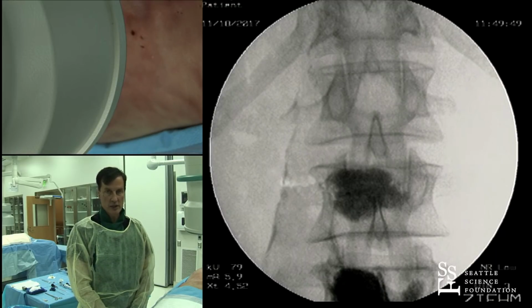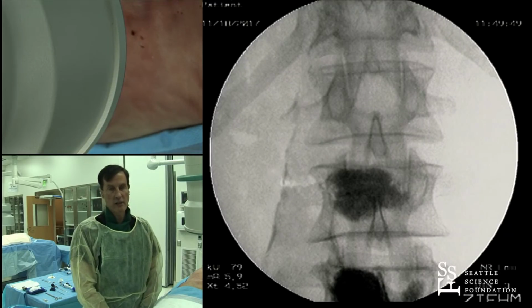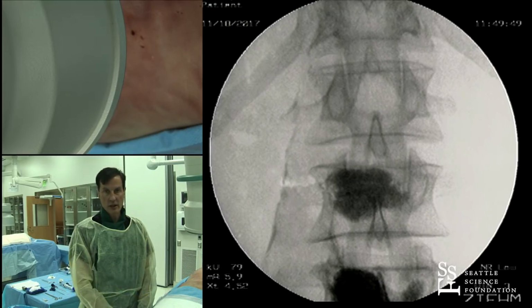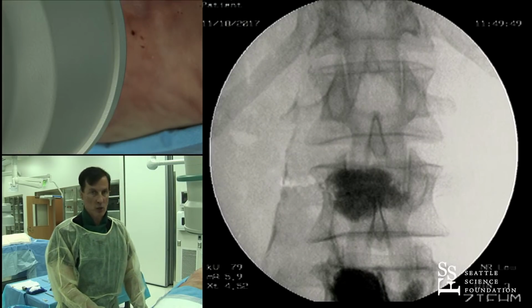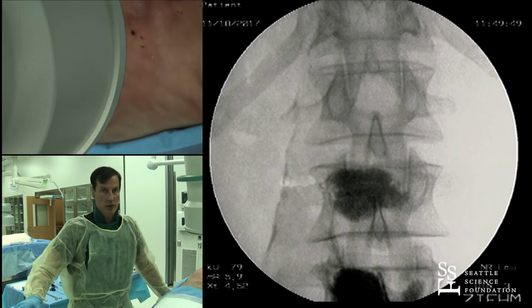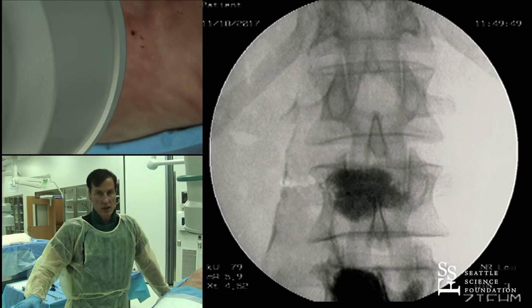If it extravasates posteriorly into the canal, that's a very important thing. Stop. The basivertebral plexus has a membrane over it, and it's lenticular in shape, kind of crescentic. If you keep injecting, that will go up and down the canal and can compromise the cauda equina, spinal cord, the conus medullaris. But if you stop, it will plug itself, and that's the safety mechanism designed in. The membrane covering the basivertebral plexus will protect you to a certain degree, but the recognition of the cement extravasation and the recognition of it going posteriorly or into the canal around the neural foramina is exceedingly important.